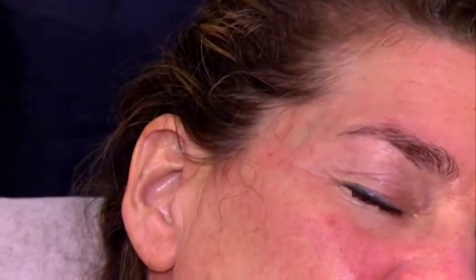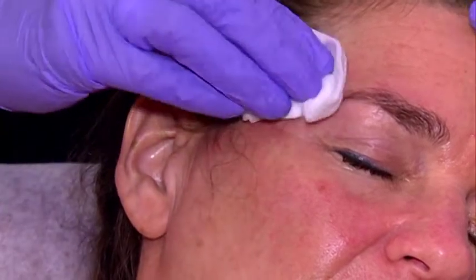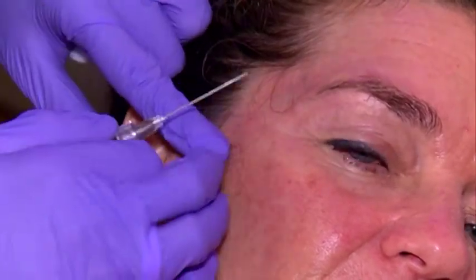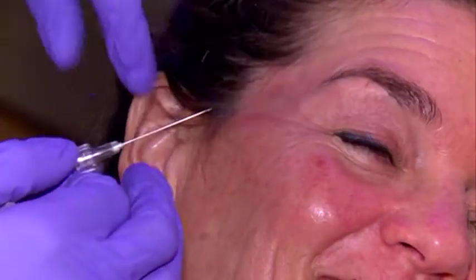Sometimes you're maybe not concentrated, sometimes you make mistakes. We are all human beings. With the Bellotero volume, you're always on the safe side because you can massage it gently and press it into the form you want. Okay? Are you good? Cool. Good.